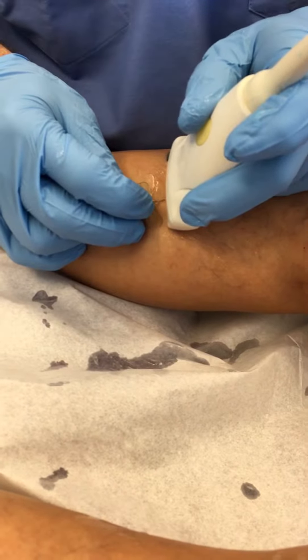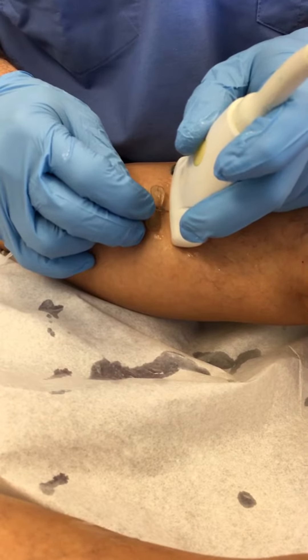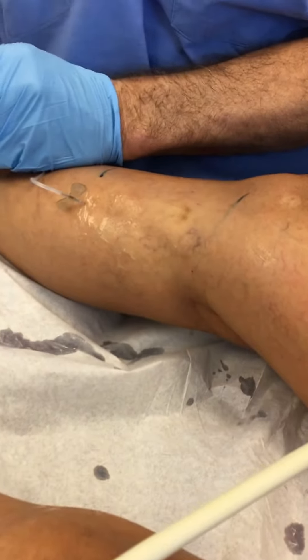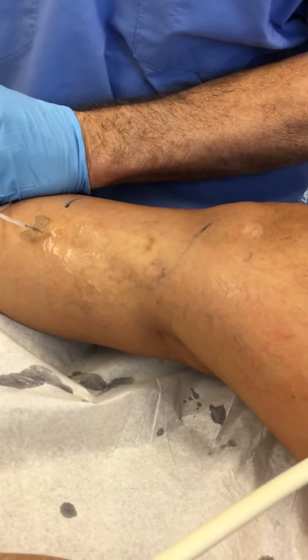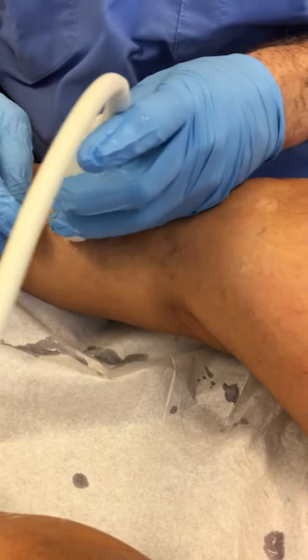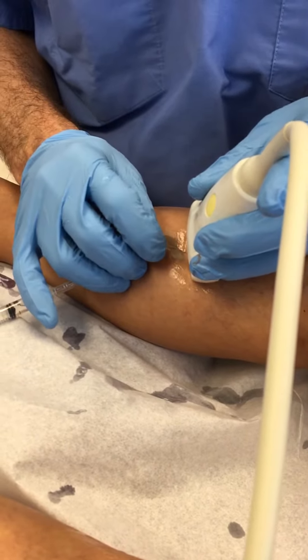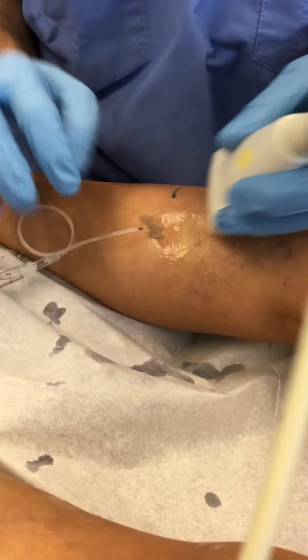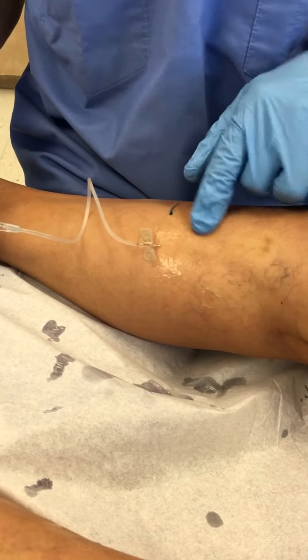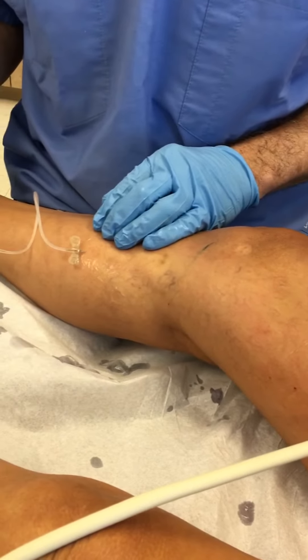I'm being very gentle with her. Let's see if we've got that or not. So you can kind of see it's a little... Sometimes the veins have been treated a little bit before. There we go — she's got it. So we've got that axis of reflux. We're going to do the same thing on her other leg, as that seems to be what's left over.